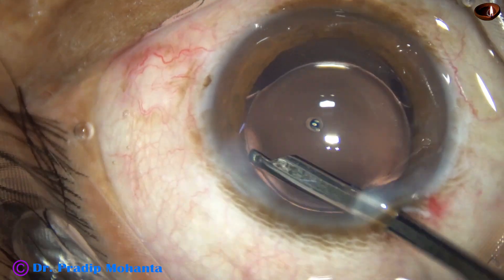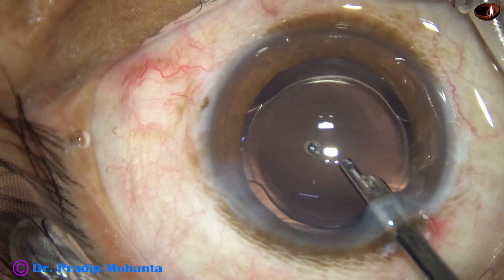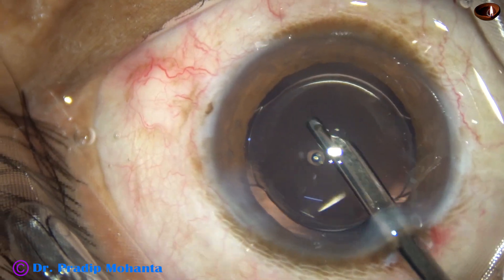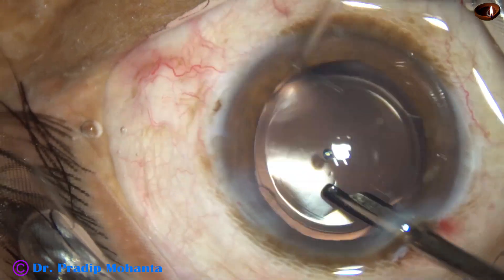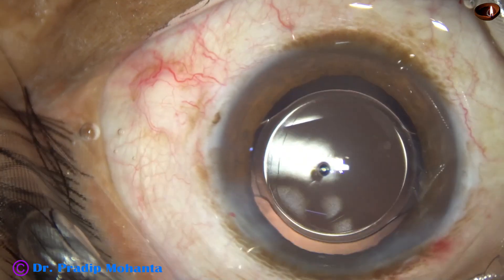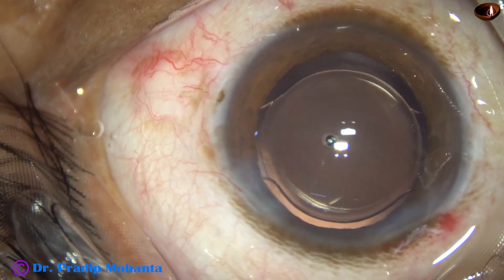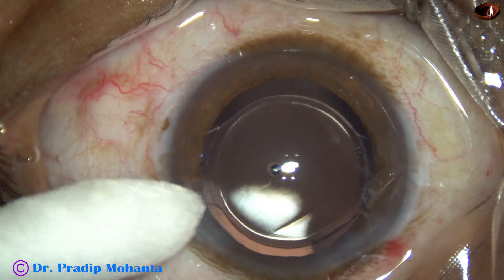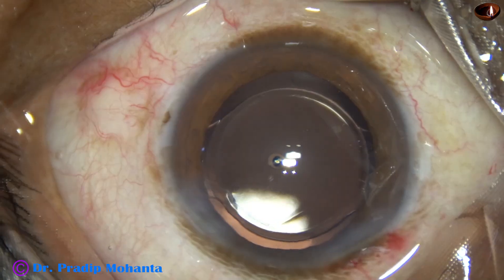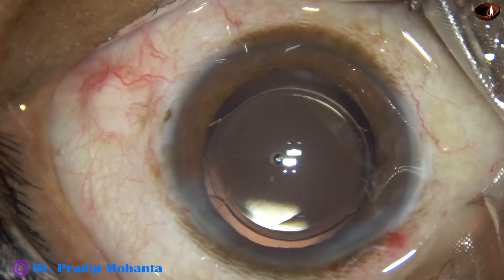After this, the anterior chamber is nicely formed and I come out. Integrity of all the wounds is checked by cotton-tipped Johnson swab. A few drops of moxifloxacin are applied over the cornea and the case is concluded.